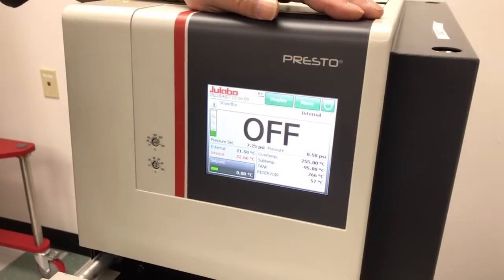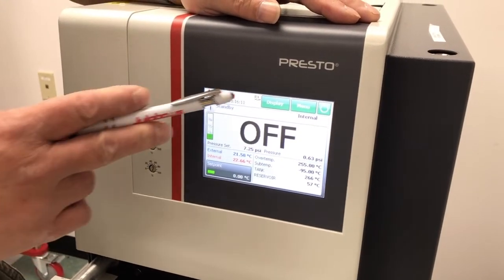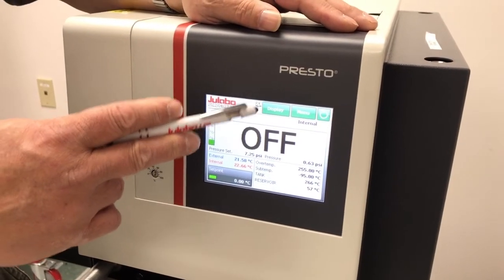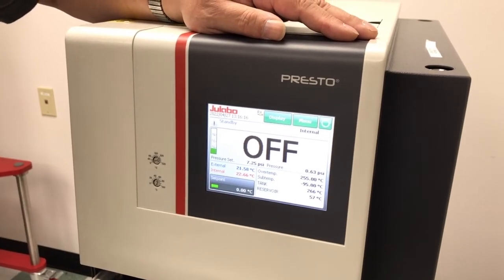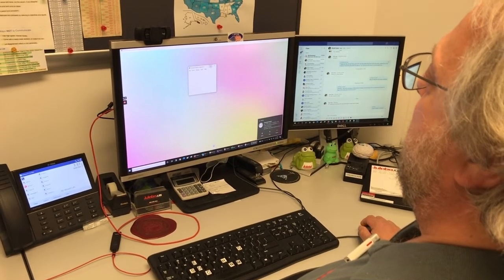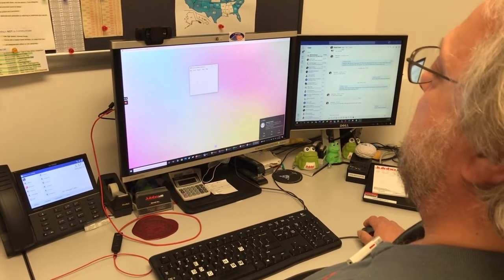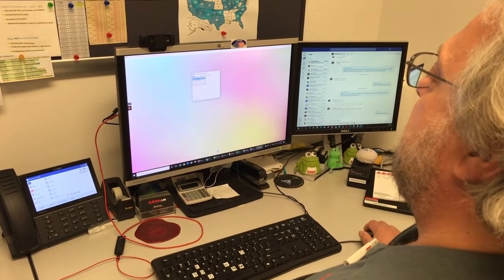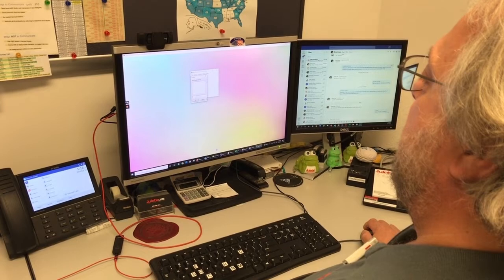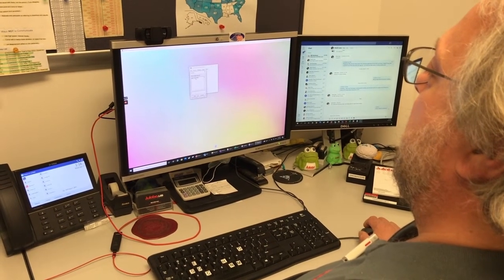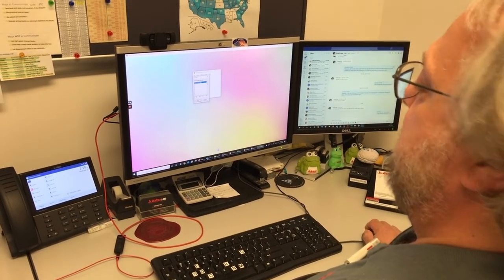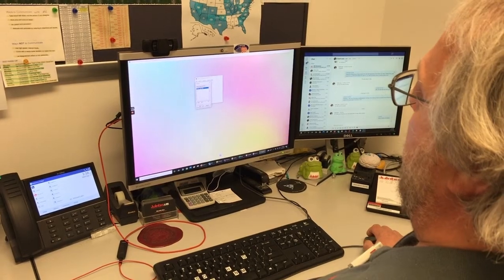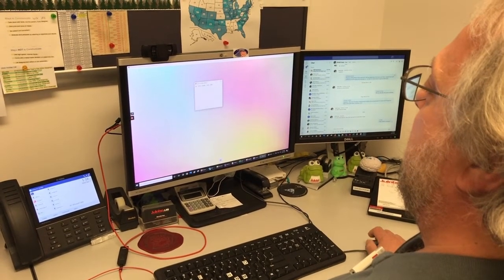Now we can go back home and you will see an R with the Ethernet symbol on the screen. First you have to open your CER host by either clicking the desktop icon or selecting it from your programs. If you have more than one, they will all be listed. Click OK.